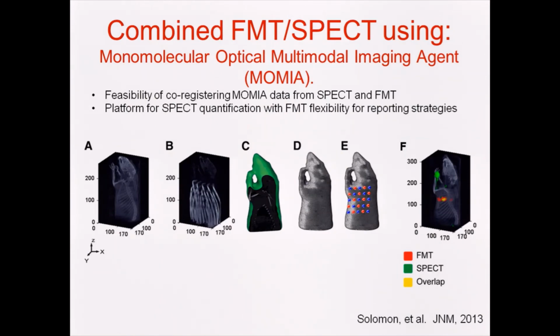Okay, so this is another system, again combining FMT data with X-ray and also with SPECT. This FMT system is now a fiber-based system. The blues are for the sources, the reds are for the detectors. By being a fiber array system, it now works as an insert. You can put it into any commercially available SPECT, CT, or PET type of system.